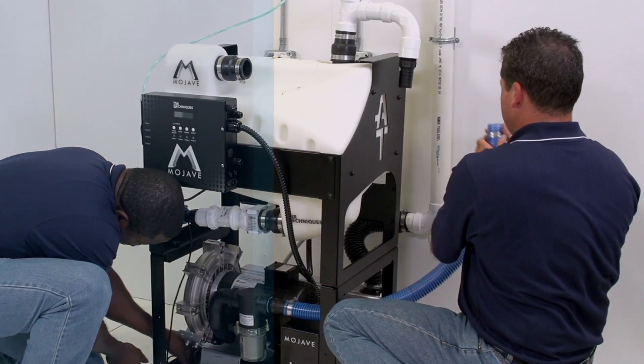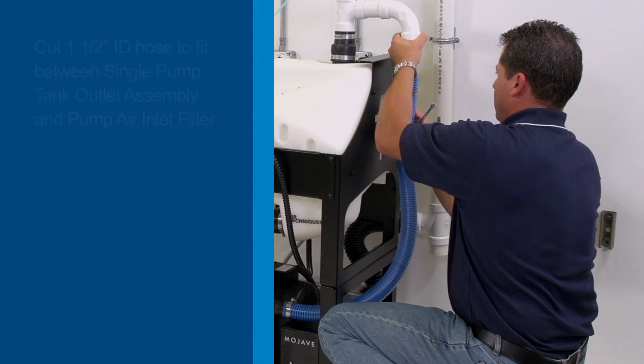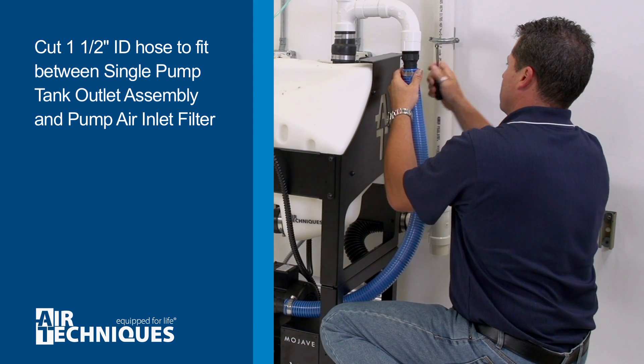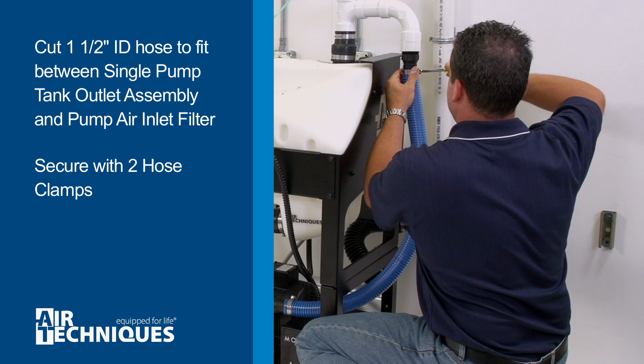When connecting the 1½-inch ID hose, be sure it is cut to fit between the barb connectors of the single pump tank outlet assembly and pump air inlet filter. Secure with two hose clamps.